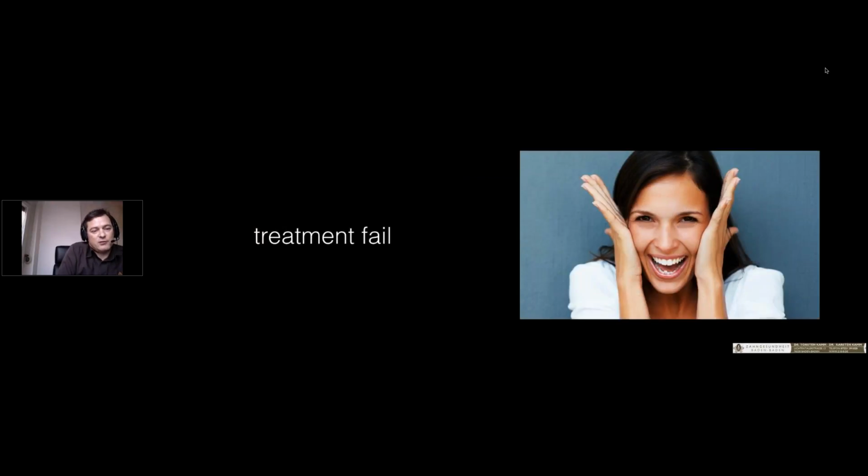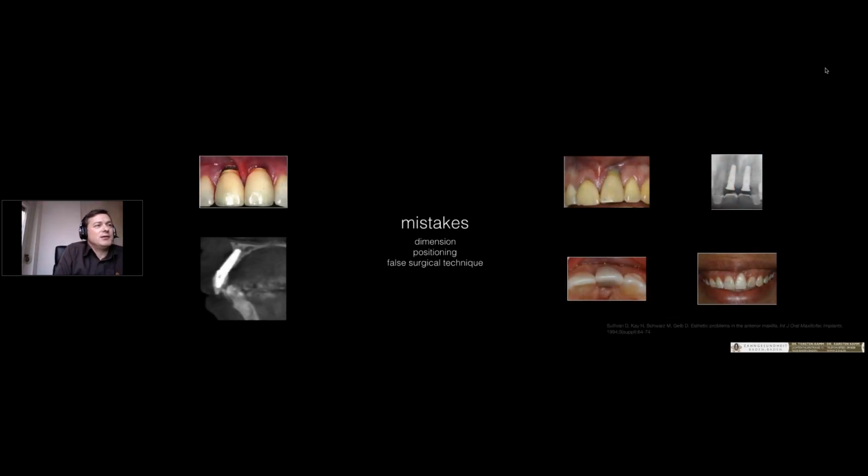So this is one slide. I made only one slide, as I found it on the internet, and some cases I have seen before in my practice. All these guys make the failures I told you before. The implants have a wrong position. Let's start with the left side.